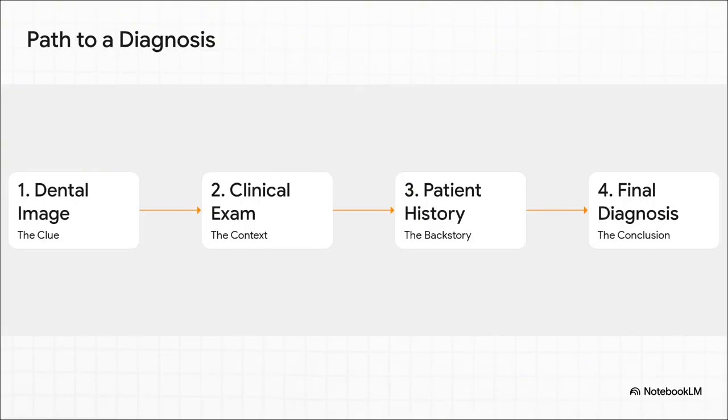As you can see here, the X-ray is the initial clue. But then your dentist adds context by actually looking in your mouth, and they get the backstory from you, your patient history. It's only by combining all those pieces that they can reach the final conclusion, a real diagnosis.